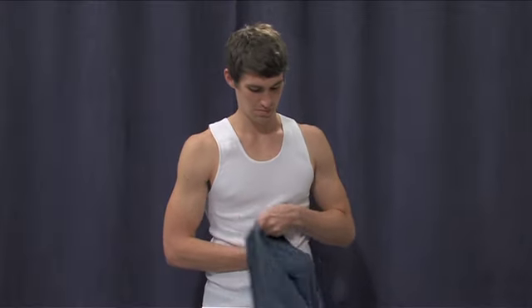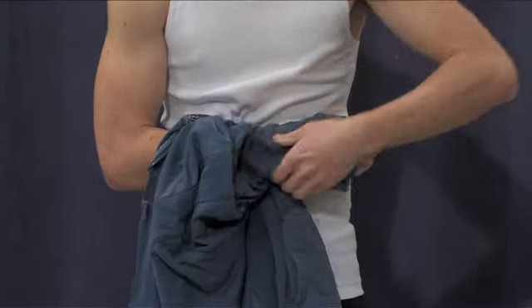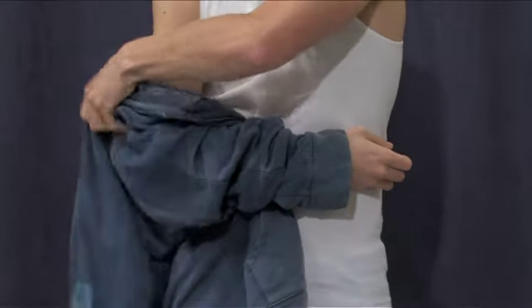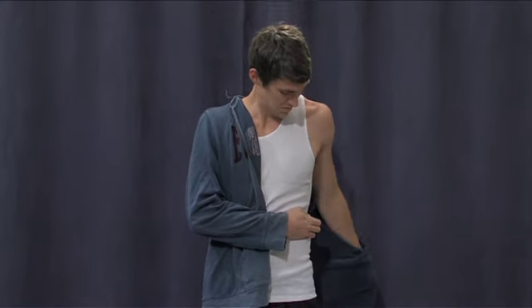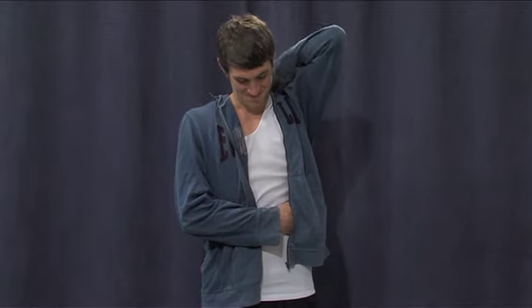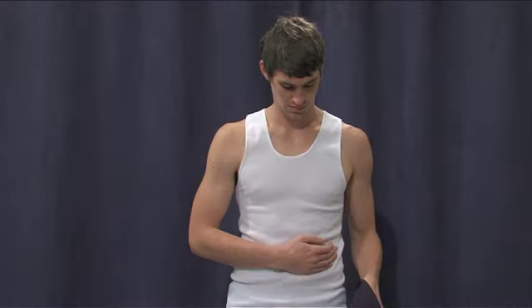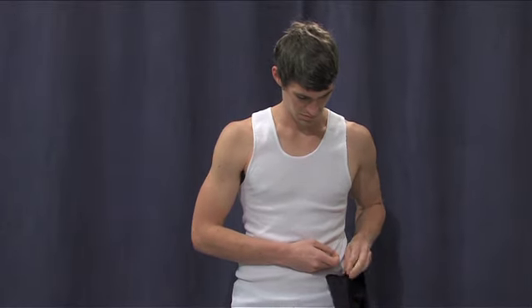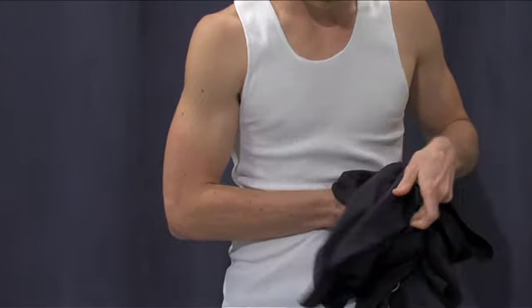Zipper front garments are easy to apply and remove. Pull the garment up and over the operated arm until it is sitting comfortably on the shoulder. With a button up shirt, place the good arm into the sleeve and do up the buttons. If you are wearing a t-shirt, after completing the operated arm, put your head through the head hole and lastly place the good arm into the t-shirt sleeve. A loose fitting t-shirt can also be used but is more difficult to apply and remove than an open front shirt.